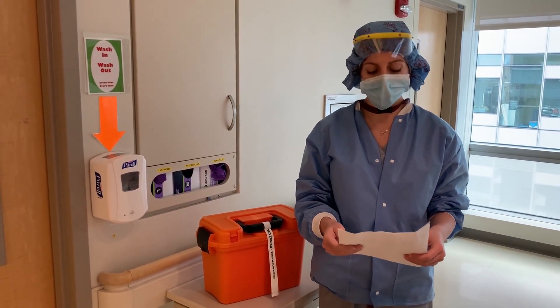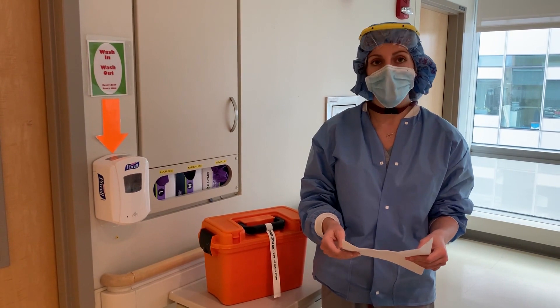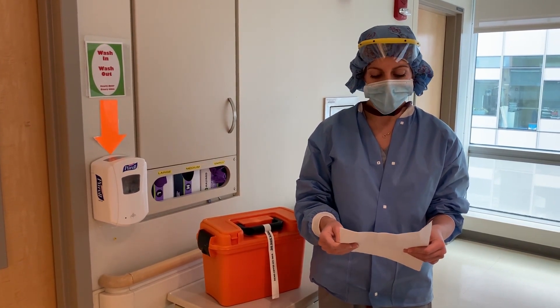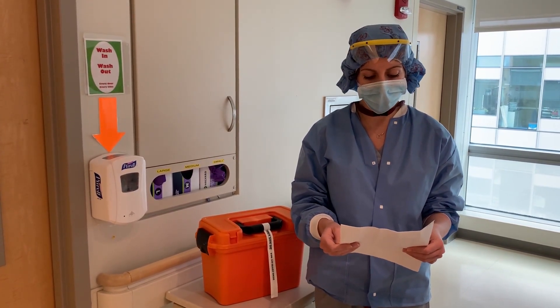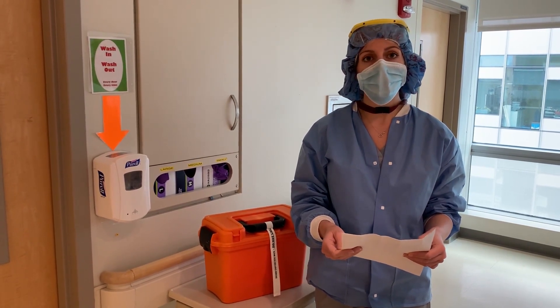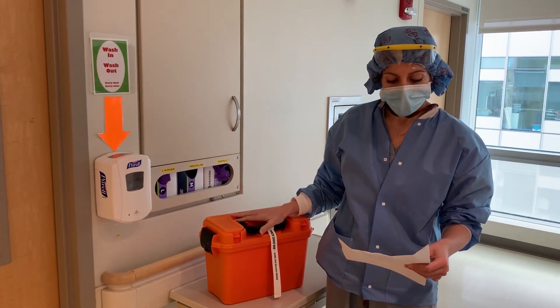Confirm the presence of your airway equipment inside the room. You should have your video laryngoscope, an ET tube, a bougie, an LMA, an oral airway, and an ambu bag. This will come from the tackle box.